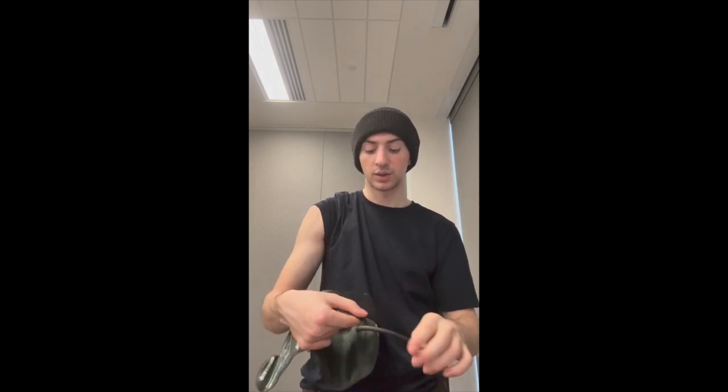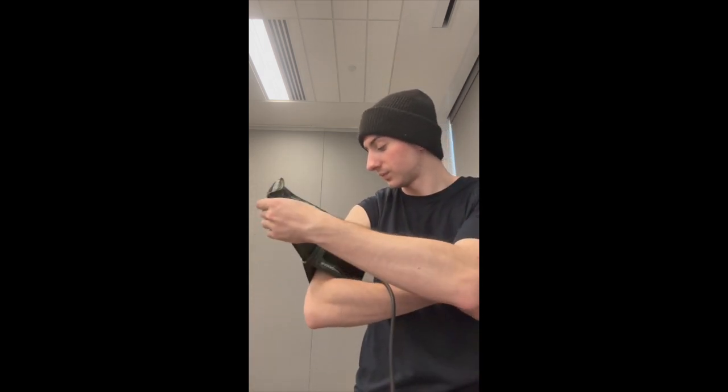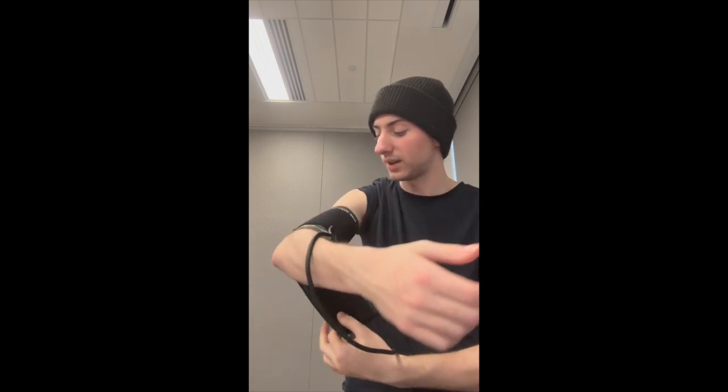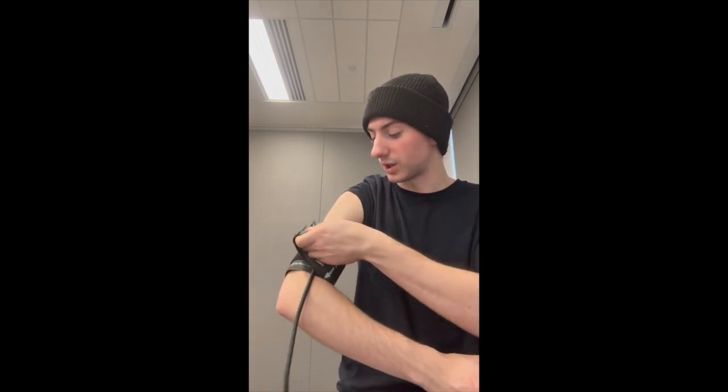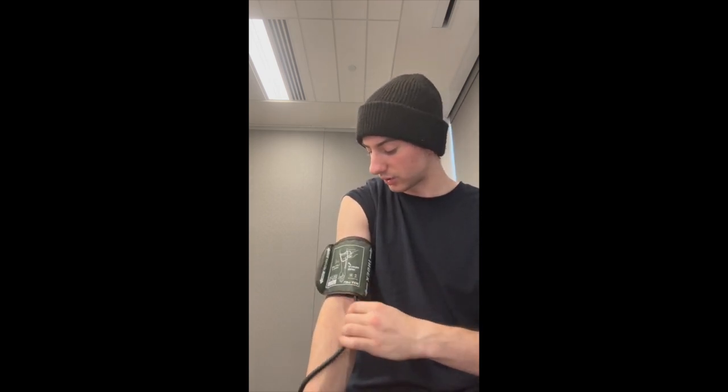So the way that you put this on is you slide it on your left arm, because your left is closest to your heart. This part right here should go on the crease and the indent in your arm. It's obviously a little hard to put it on myself, but you put it on tight and adjust. Again, the left arm, this is where your artery is, so that's the best place to put it.